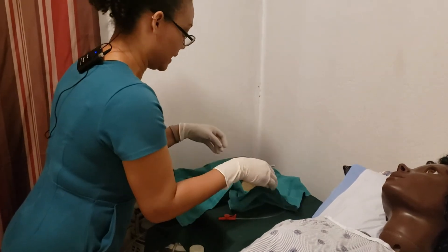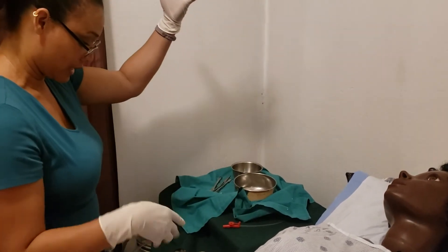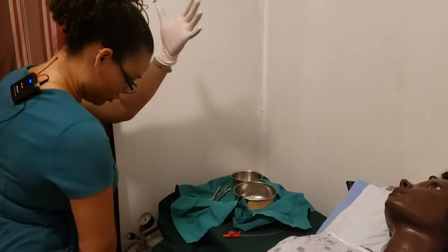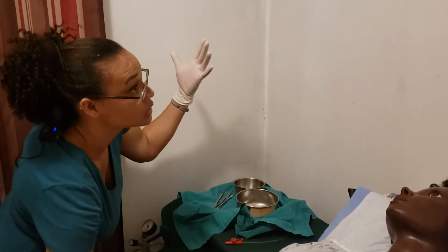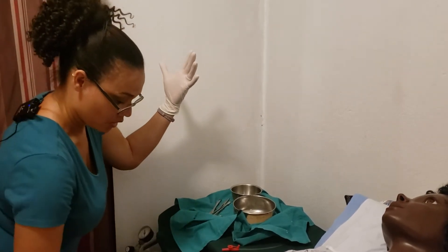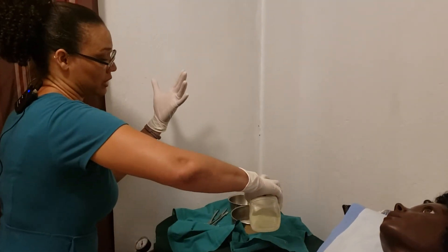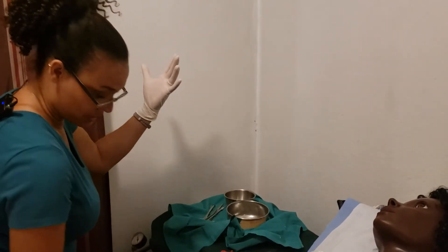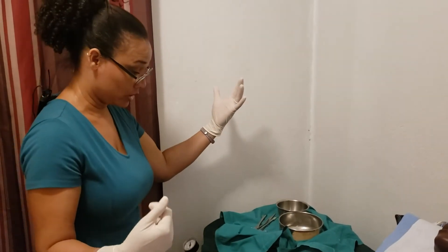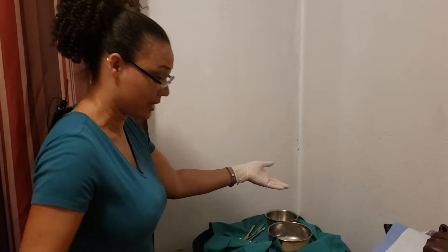We go ahead and open up the tray and put our bowls where they need to be. Now I have one sterile hand and one clean hand. I'll take my lube, put some out, making sure that I loosened the container earlier so I can take off the cap and place it with the bottom down. I've checked the container and the fluid, confirmed the date, and now I'm going to pour it — making sure that I don't wet the material so that I don't create an unsterile area.